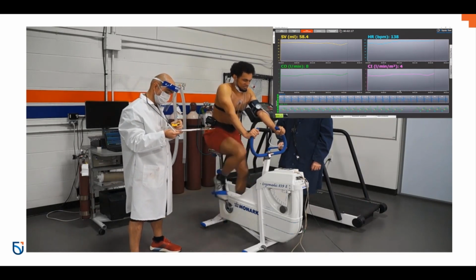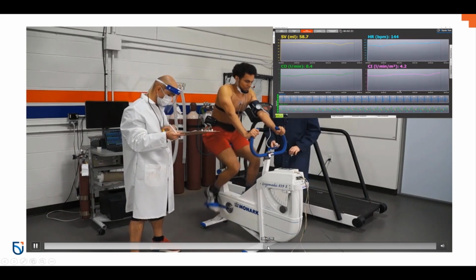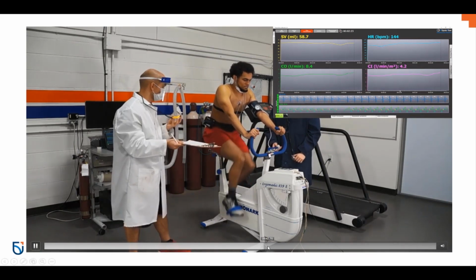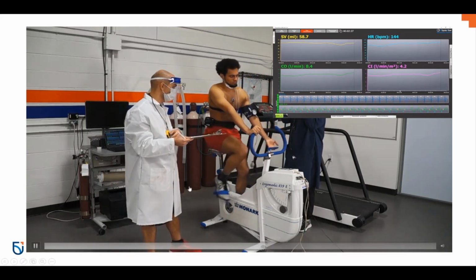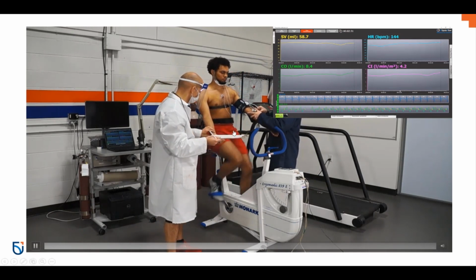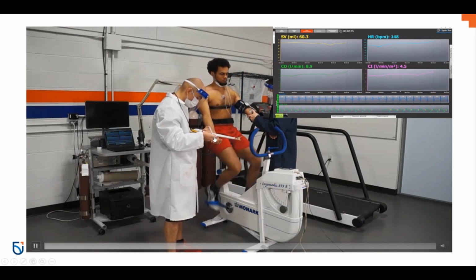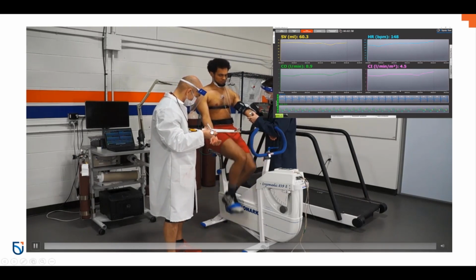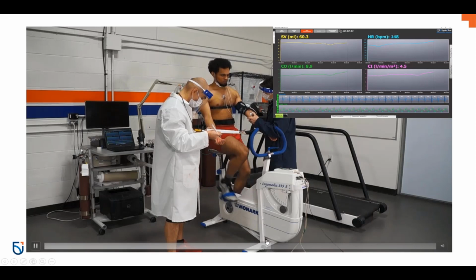We're making sure that we're ready to go for everything we need on the test, because once it gets harder, it gets a lot harder to reach down and change the pedal or any of those things. Nick here is acting as the blood pressure monitor, actually, I was doing blood pressure. He's doing radial palpation just to make sure the heart rate is correct. He's also keeping track of time and RPE.